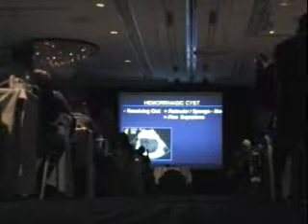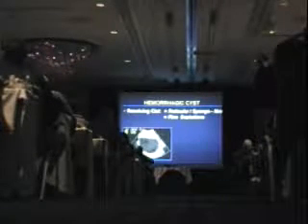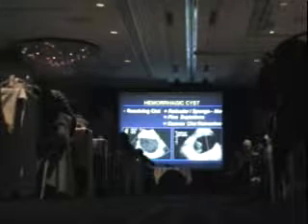Acute clot, we can see here a nice example. As clot resolves, it undergoes an evolution, if you will, in which case it becomes, and it's difficult to know how to describe this, but I would prefer the words reticular-like material, spongy, cobweb, that's a good adjective. If you're going to say septations, say fine septations without vascularity in the septations, because you're describing something that should be avascular, an evolving blood clot, and that's quite important.